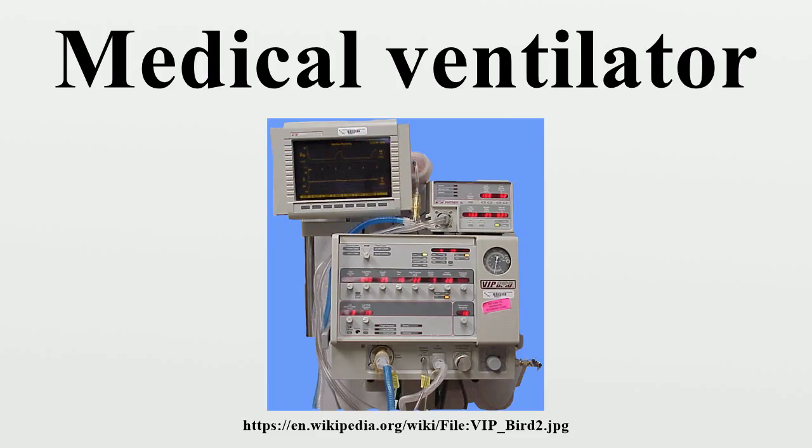Life-critical system. Because the failure of the mechanical ventilation system may result in death, it is classed as a life-critical system, and precautions must be taken to ensure that mechanical ventilation systems are highly reliable. This includes their power supply provision. Mechanical ventilators are therefore carefully designed so that no single point of failure can endanger the patient.